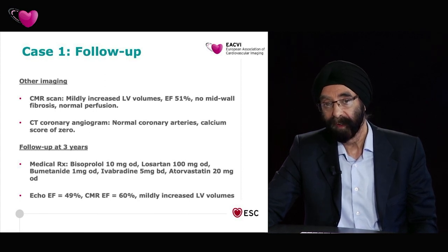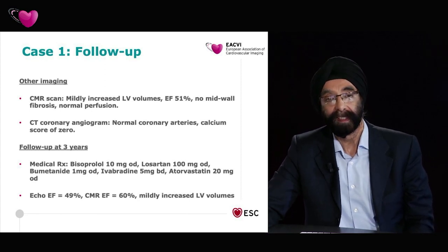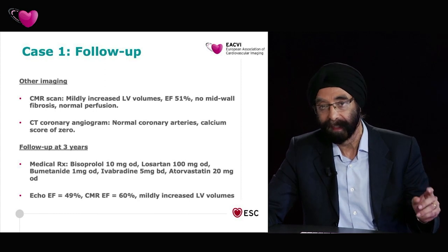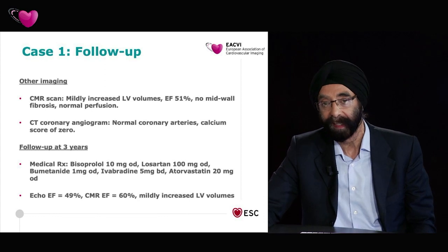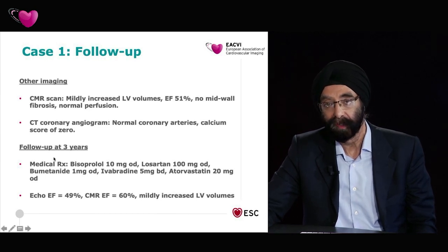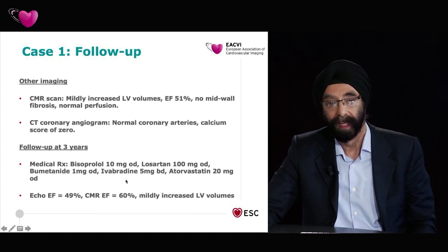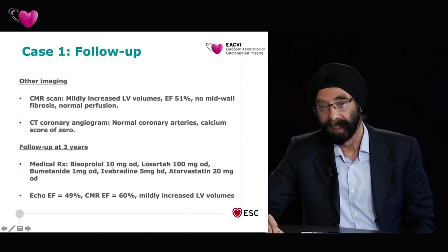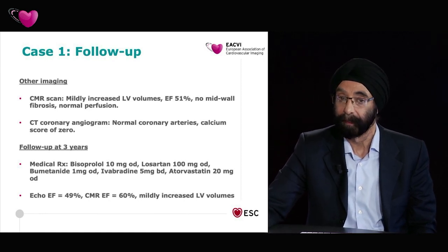So this is a very interesting case. If we take it in the context of coronary artery disease, this is, in inverted commas, a false positive test. But what it is showing is true pathology, true findings, and not relevant to coronary artery disease. It's another disease process. The patient was then treated with beta blockers, ARBs, and so on and so forth. And the patient had maintained the left ventricular function over the following 3 years with an improvement in symptoms.